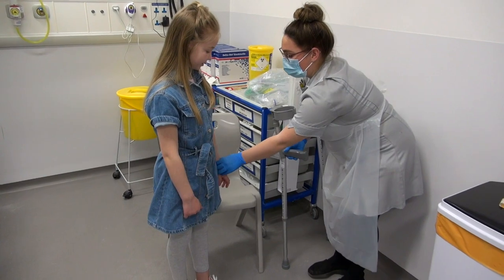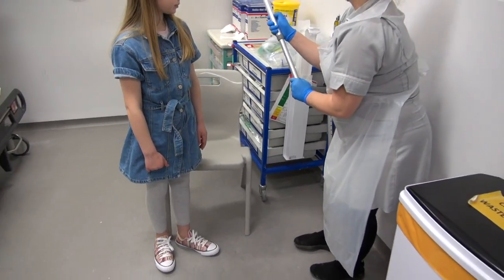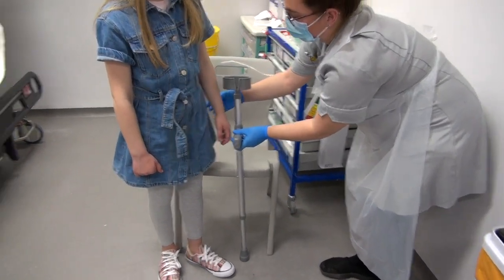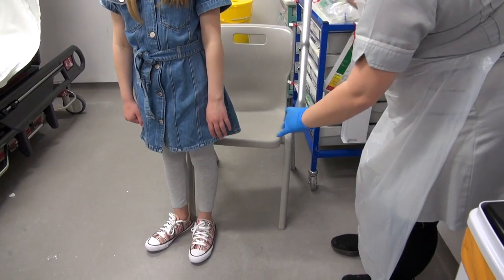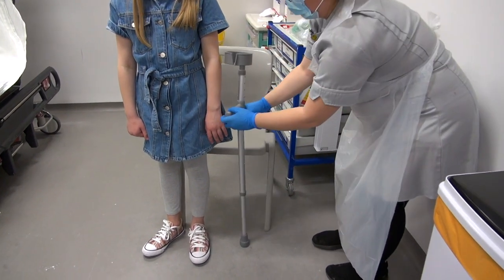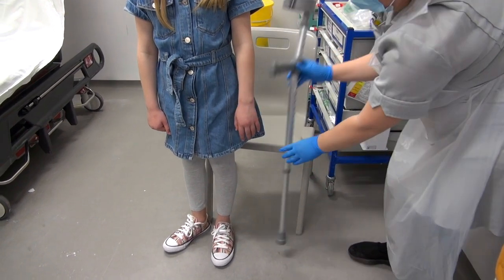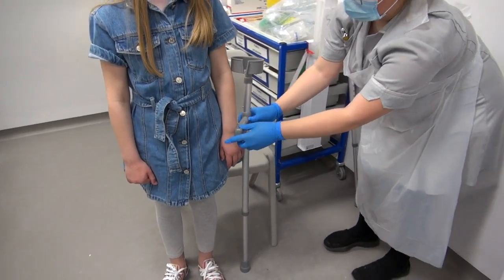So just flex your arm down the side of your forehead. Keep your arm down the side of your forehead. Perfect. And just twizzle — just face that way. Perfect. And just go a little bit taller.